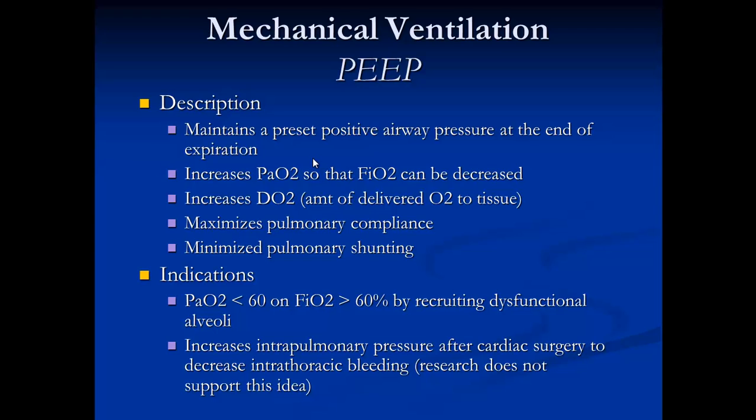unless the patient has neurological problems. If you receive a patient with an altered mental status with unknown reason, or the patient is unconscious for unknown reason, and CT scan of the brain or MRI of the brain is still pending, you have to avoid starting PEEP, because remember, PEEP increases intracranial pressure, and also PEEP reduces venous return and preload. So the higher the PEEP, the lower the blood pressure.